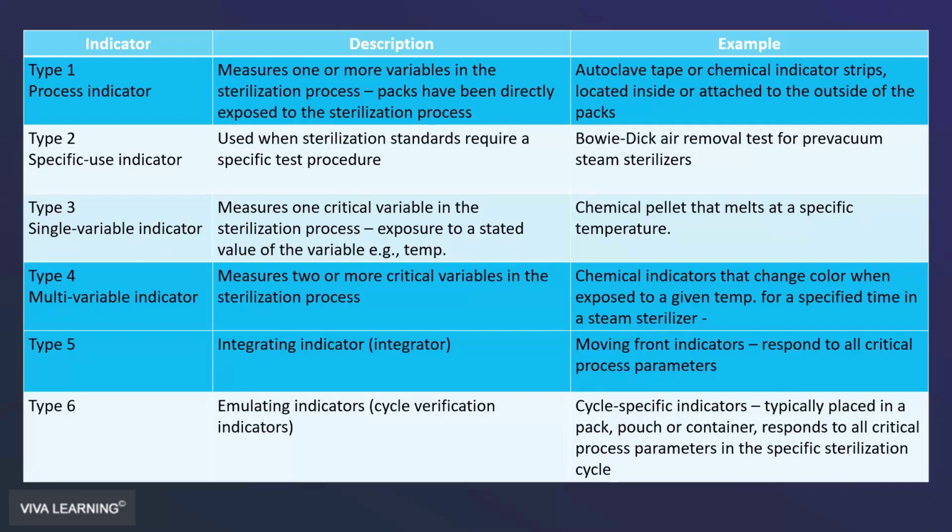If they say that you can put them in an immediate use sterilizer, packaged, yes, but again, keep in mind, it's not meant for routine use. It's meant for immediate use. Now, if you're short on inserts, then you could make a rationale for that.